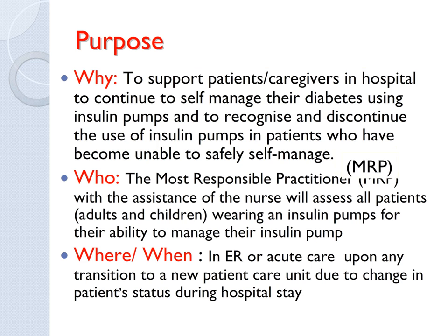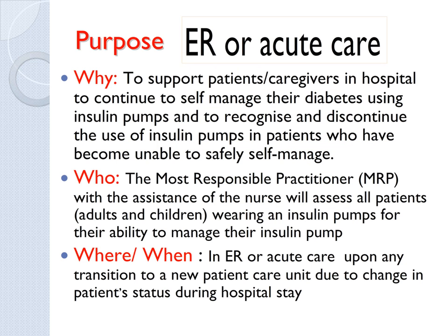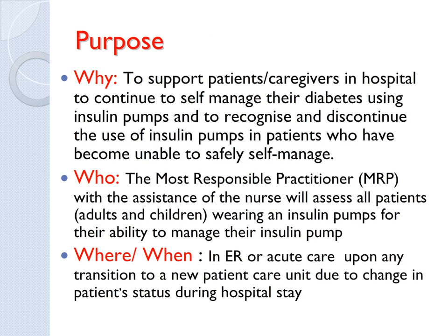The most responsible physician, with the assistance of the nurse, will assess all patients, adults and children, wearing an insulin pump for their ability to manage the insulin pumps in hospital. This applies to the emergency department or acute care. Patients will be reassessed on transitioning to a new patient care unit due to changes in the patient status, such as leaving or entering the ICU, or leaving or entering the surgical floor.